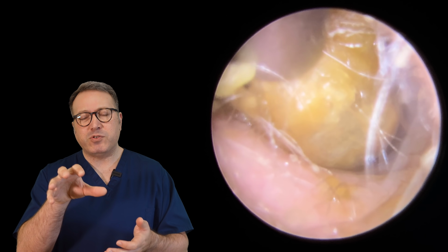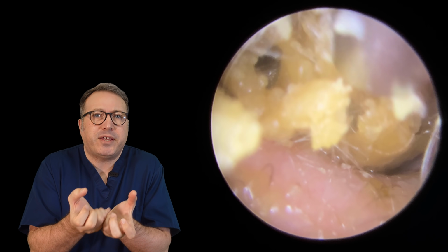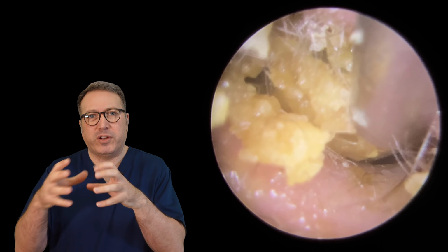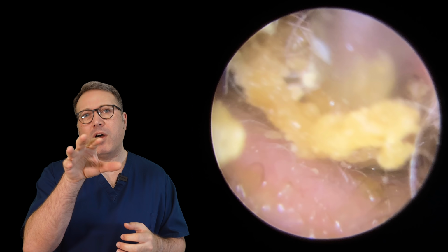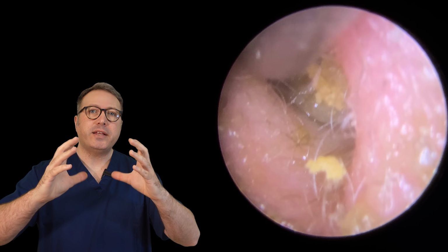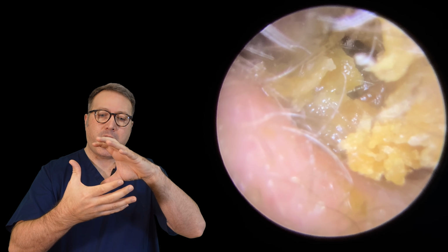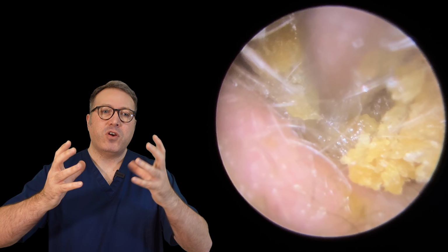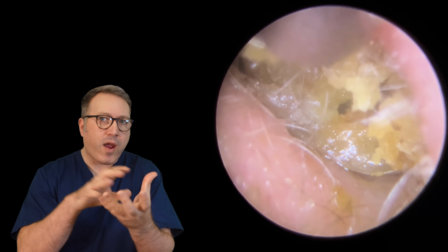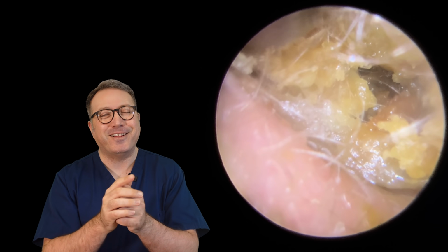But what we can see here is we've got this dry, almost hardened up skin, what they call a keratinous skin. So basically, imagine skin goes almost like leather when it's detached too long. It gets really toughened up. Now what happens here is that there's actually a piece of wax in the middle of all this, but all the side canal walls there, which have dried out and detached, have all gone around the wax. So you've ended up with almost a cocoon of dry, hard skin around this plug of wax in the center, if you like. So I would use a food analogy, but I'm going to avoid it.